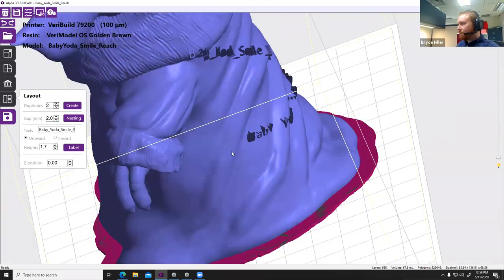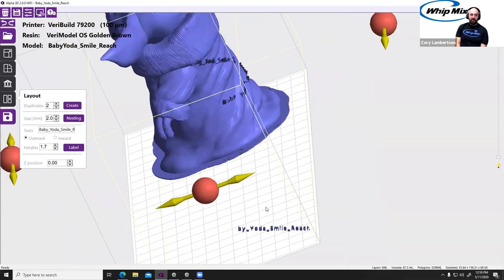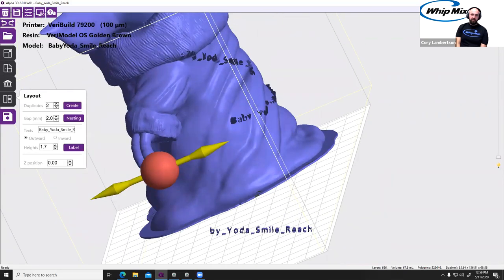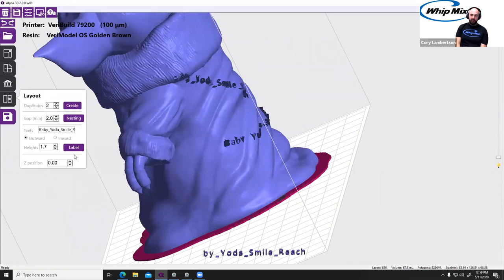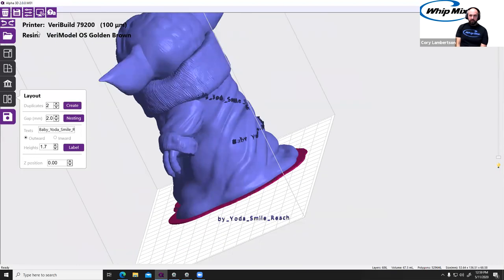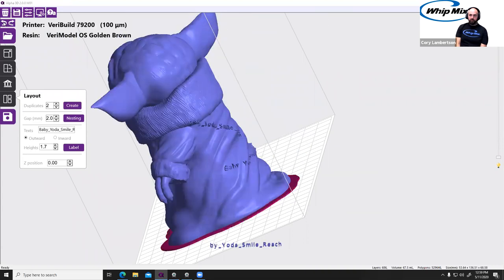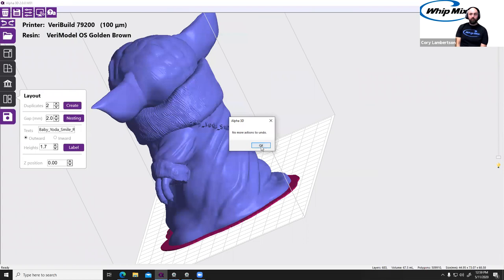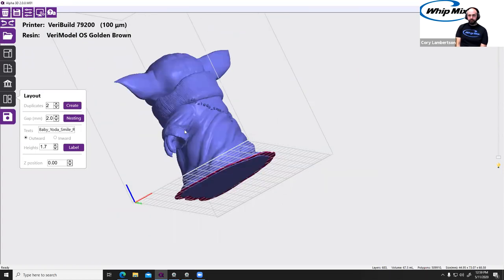Yep. So the text, you can see Bryce is having some fun there. The text takes a little bit of time to get used to. But on the top bar, you can see you put three texts. There's actually an undo button on the top left-ish. There you go. So you should be able to undo to the point of the text. So if you put it in a position where you didn't want it, or if you put too many, then you can undo. Sweet.